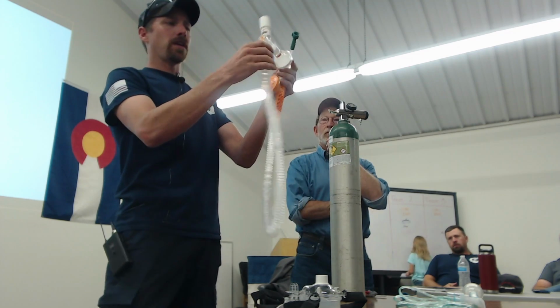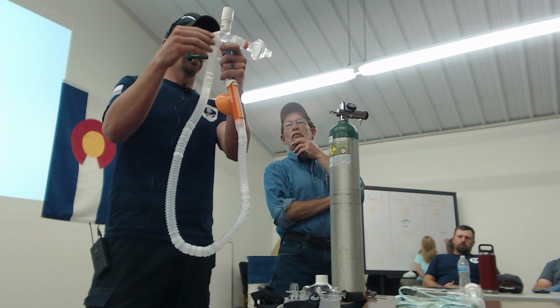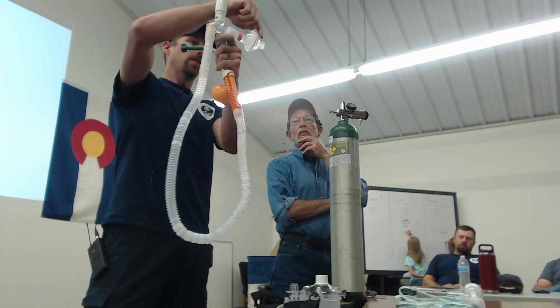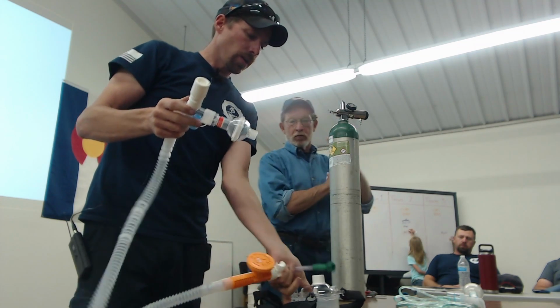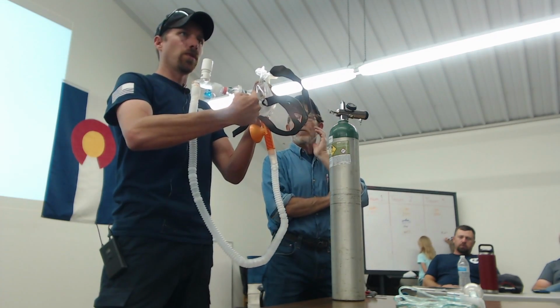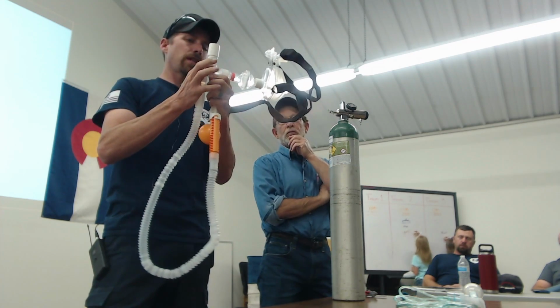So it travels up into here. In this configuration right now, it's going to travel through a HEPA filter. Again, this will also be a two-way filter because you're going to be filtering both the inhalation and the exhalation. This is this particular setup.